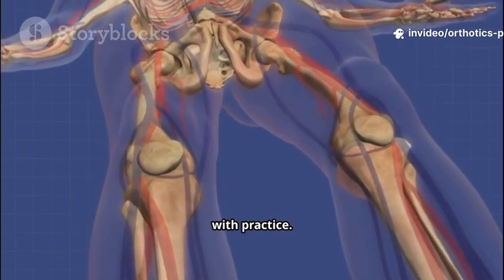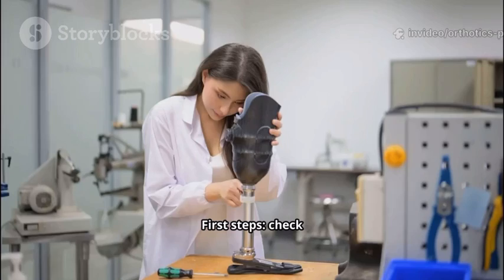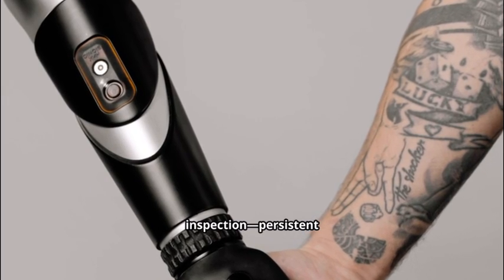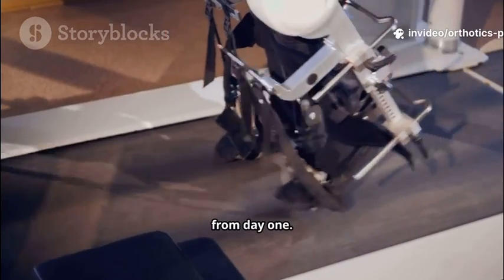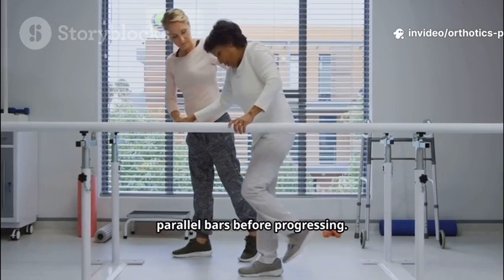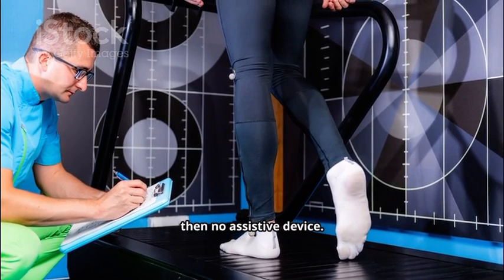Skill grows with practice. When starting with O&P, keep it simple and focus on fundamentals. First steps: check fit and check the skin. Teach skin inspection. Persistent redness signals excessive pressure. Emphasize skin care from day one. Build confidence gradually. Start in parallel bars before progressing. Progress to a walker, then crutches, then no assistive device.